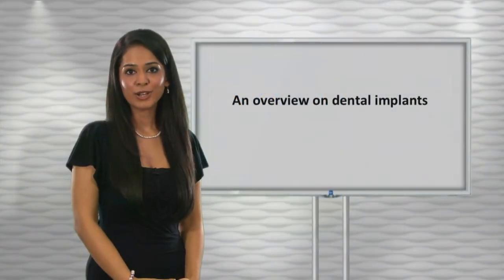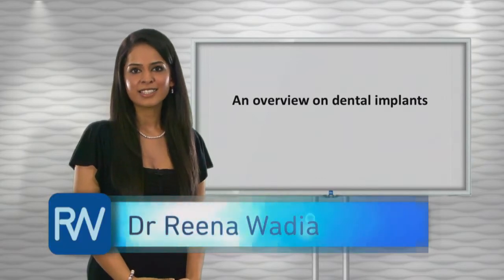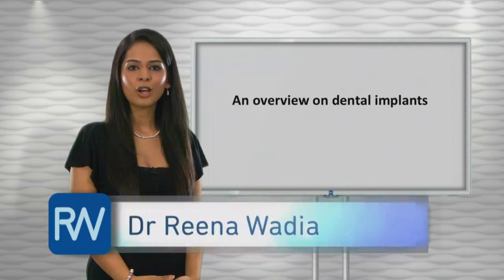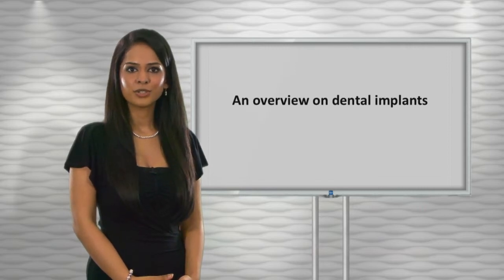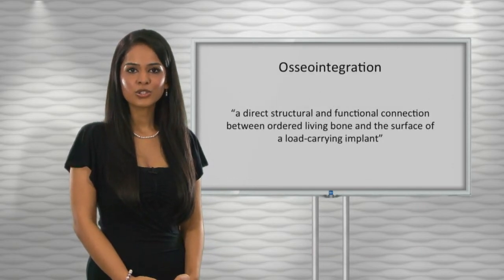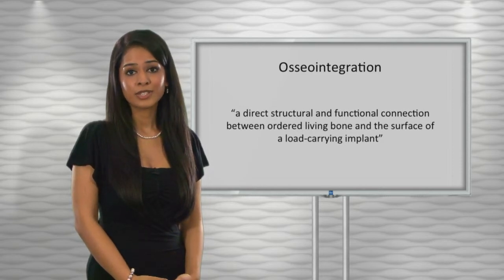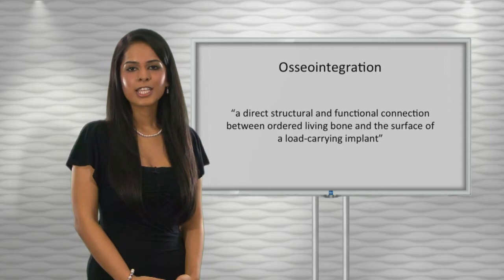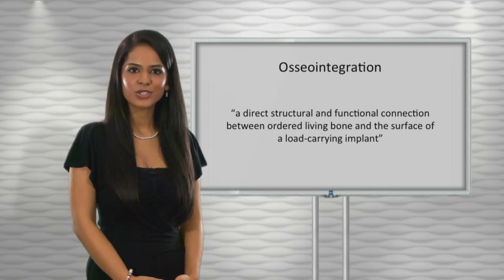In the last decade, implantology has become an indispensable part of mainstream dentistry, helping dentists to improve the quality of life of large patient populations. The phenomenon of osseointegration of implants was discovered in 1952 by a Swedish orthopedic surgeon, Professor Brånemark. He defined osseointegration as a direct structural and functional connection between ordered living bone and the surface of a load-carrying implant.